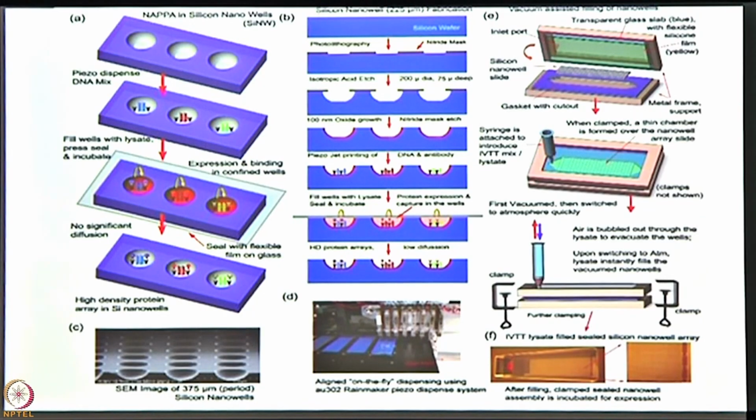It took a lot of different mapping methods on the photolithography side to create wells that had this sort of bowl shape at the bottom, because typically photolithography wants to make a straight wall and a flat bottom, and it turns out that the signal intensity was not as good in that format. The other thing that's not easy is printing the DNA into the well.